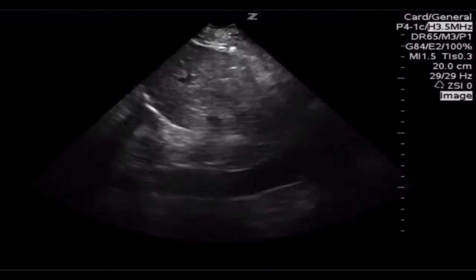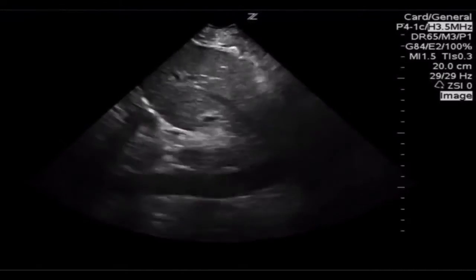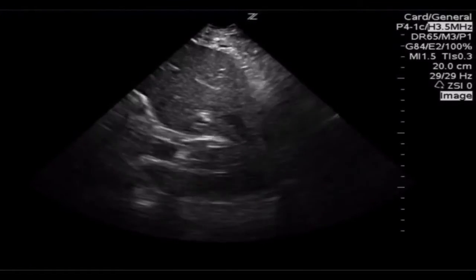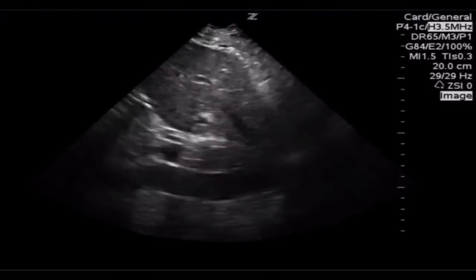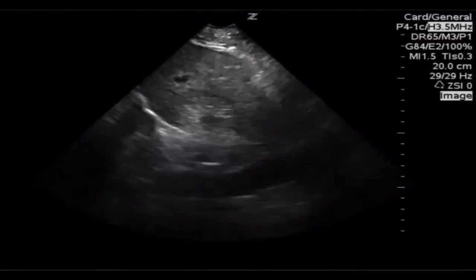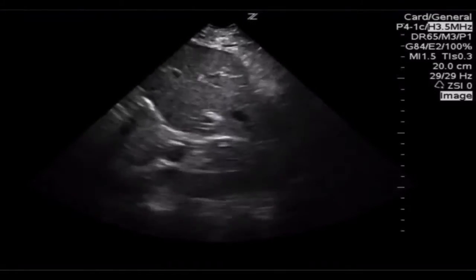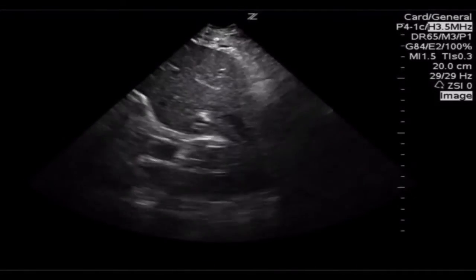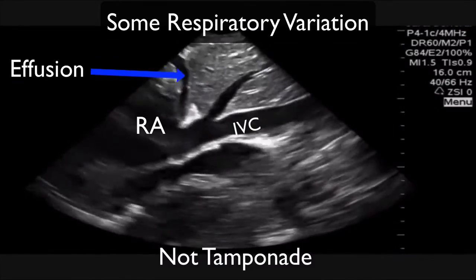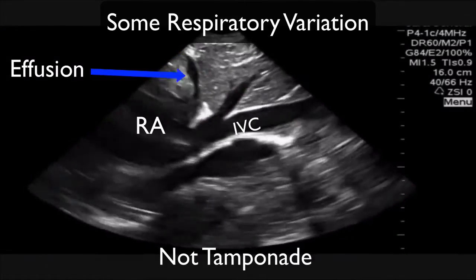And this is an important finding in any condition that creates an obstructive shock pattern. So in tamponade, you have obstructive shock because the RV is being collapsed. Blood cannot get through the RV, cannot get through the right atrium either, and therefore backs up into the inferior vena cava. If you look at the inferior vena cava and you're concerned about tamponade, but you see a lot of respiratory variation, then tamponade is basically taken off your list. It should no longer really be in the differential because you're going to have a huge amount of backflow into that IVC.